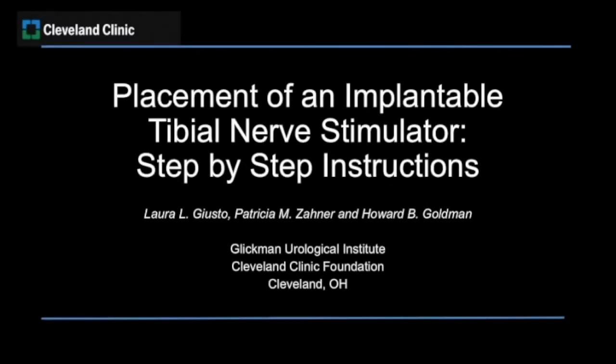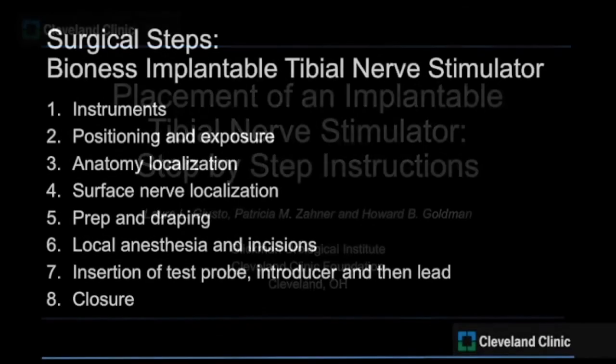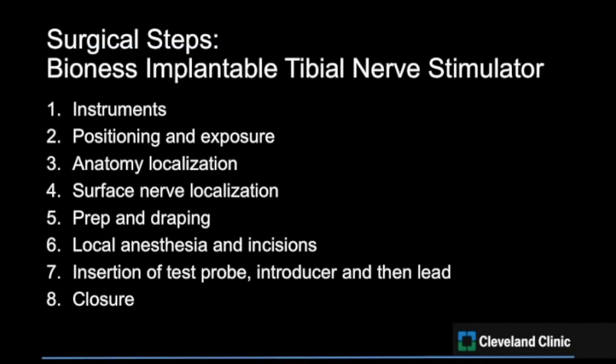We present an instructional video for the placement of an implantable tibial nerve stimulator for the treatment of overactive bladder. This video will highlight the steps taken during placement of the Bionis implantable tibial nerve stimulator.